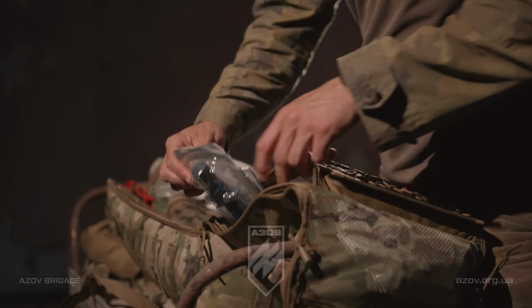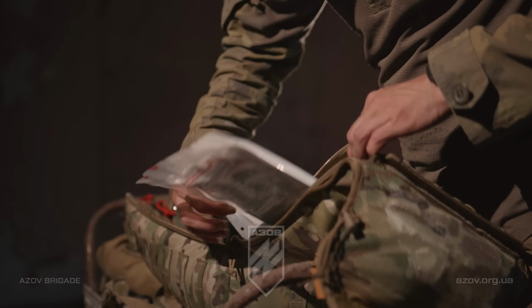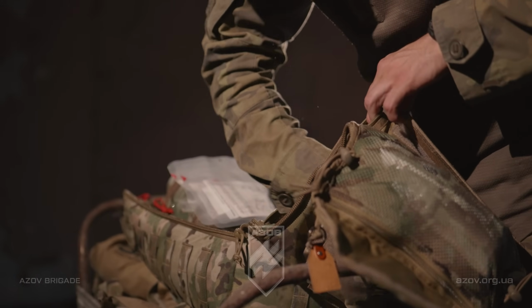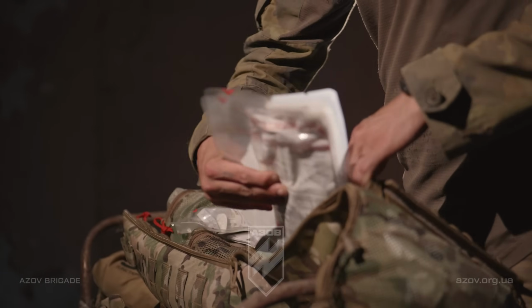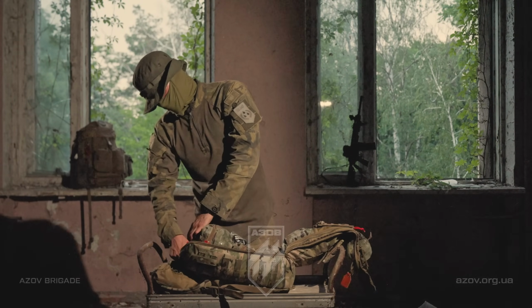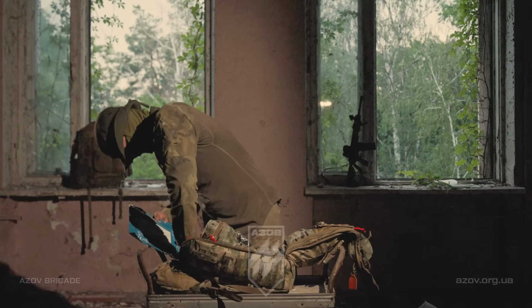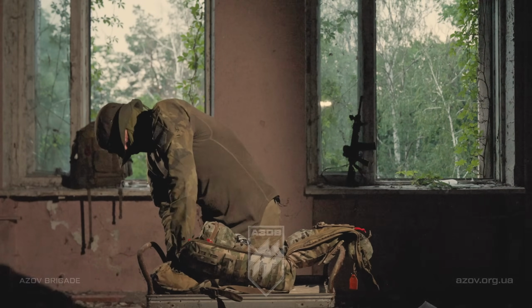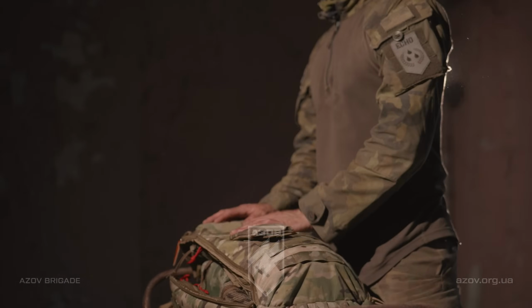X-stat, IO device, a larger X-stat, a couple large X-stats here. And then there's some more catheters, a spare IO, the lines for the IO. And then, there in the back panel here as well, I forgot to grab that out. They also have a ready heat as well, which is accessible. They don't have anything else in the back on this section here. And that's like the basic issue bag you're going to get.